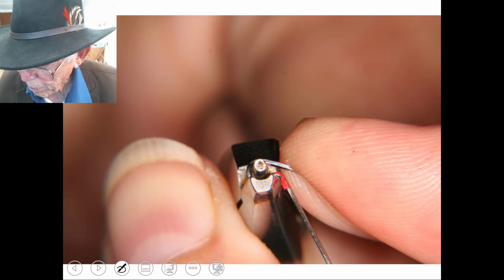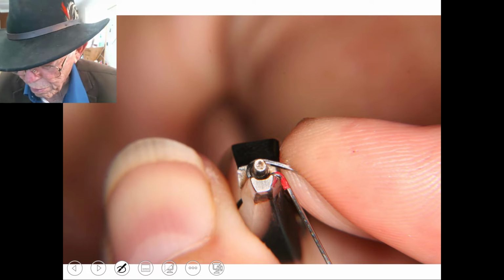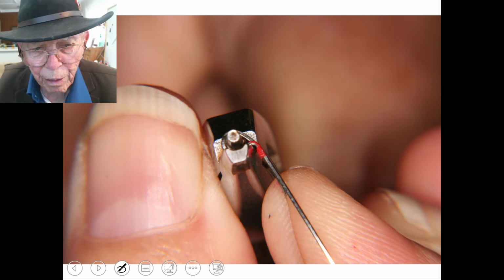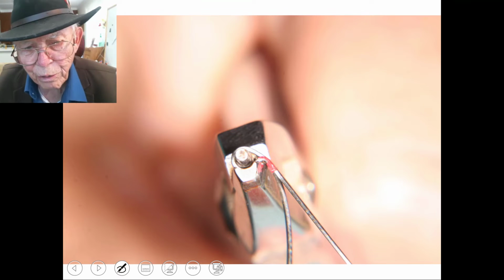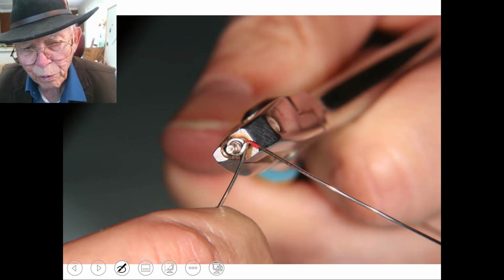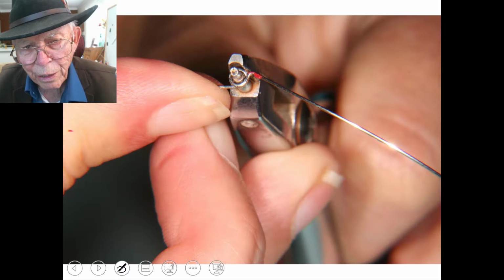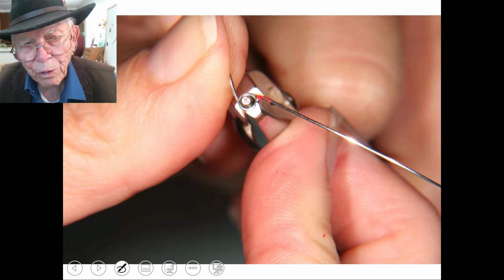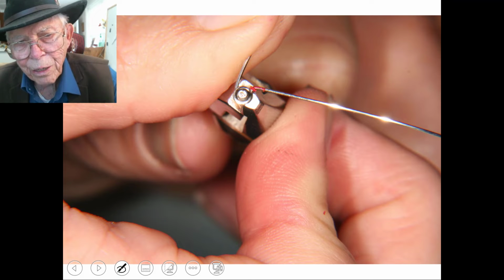Now we'll move pretty fast here, I think, and then I'm going to go around it. I make a decision here to go inside or outside where you want the wire to come, the spring to come out or in. There, we're going to go in with it, and there we go around the second time, and we come up to the top and head up in this direction.